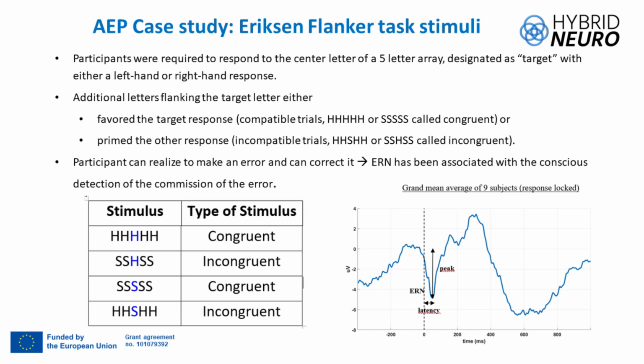This experiment, you can observe on your screen 5 letters, different options which can appear on the screen, and you ask the user or the patient to respond with your left or your right hand depending on the letter, H or S. Okay.